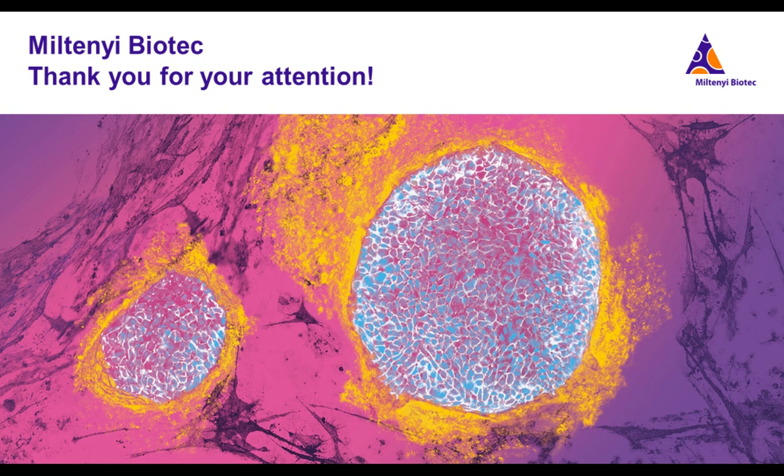Now, how do you fix the tissues for the staining protocol? Do you recommend any particular reagent? Basically, we have tested our entire antibody portfolio on 3 different fixation methods: FFPE with the epitope retrieval protocol based on pH 9 Tris buffer and heat, PFA, and also acetone fixation. If I have to recommend a fixation method, that is very much dependent on the application.